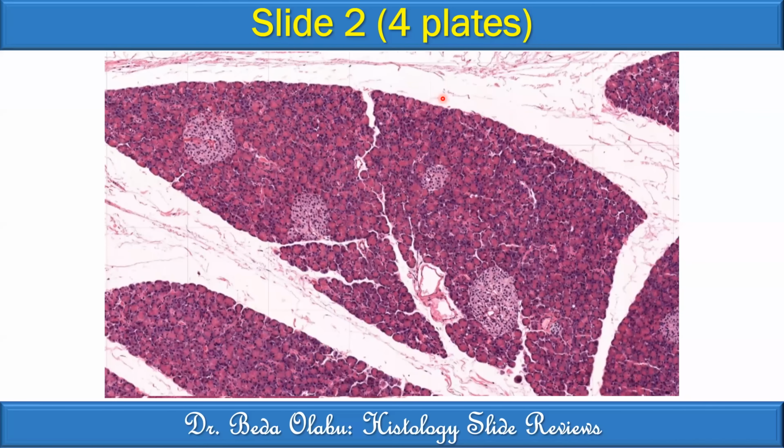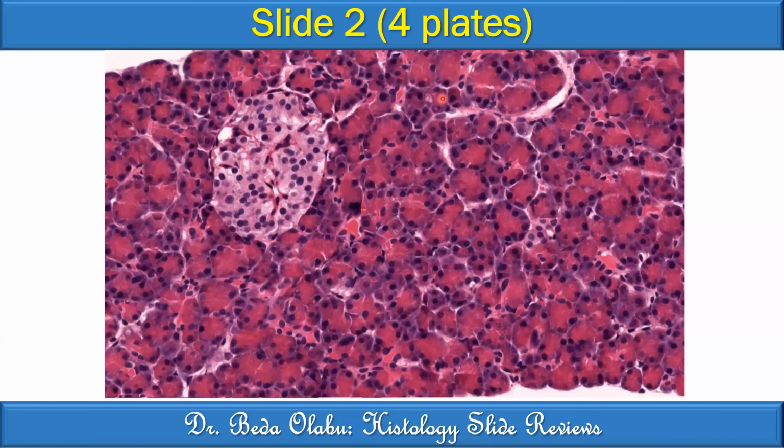On the third magnification, I think I can see islets of Langerhans, maybe. Not sure. Okay, I don't think that's a description. What you said last, that Langerhans, is not a description. What is it that is histologically descriptive, what you're saying?